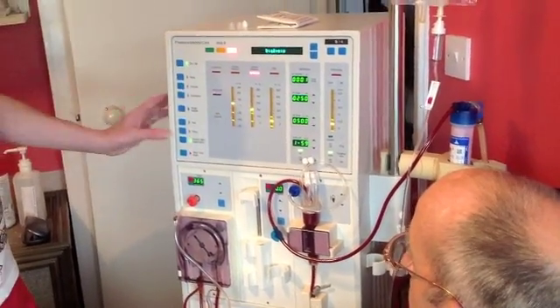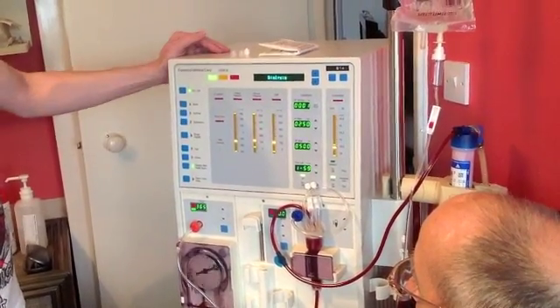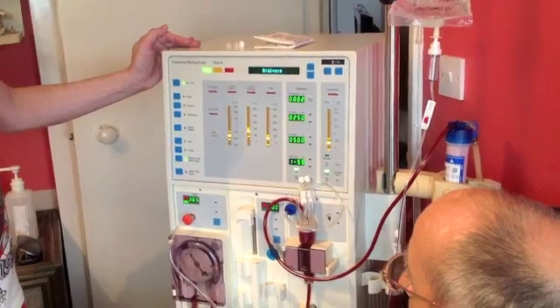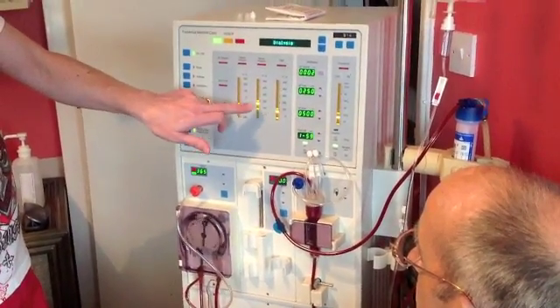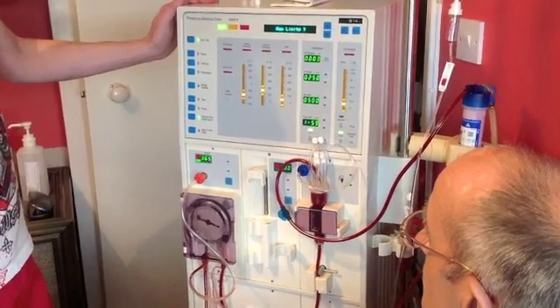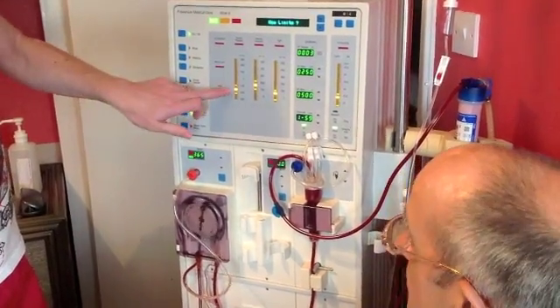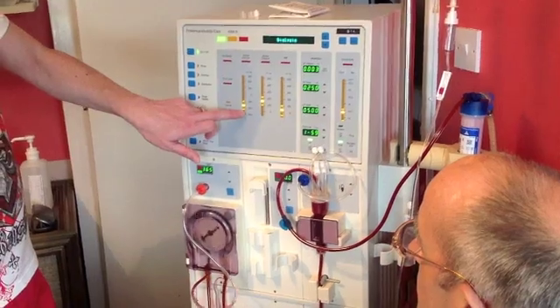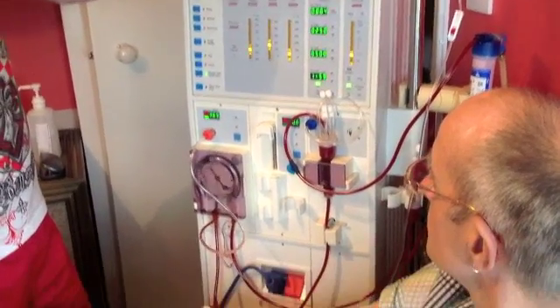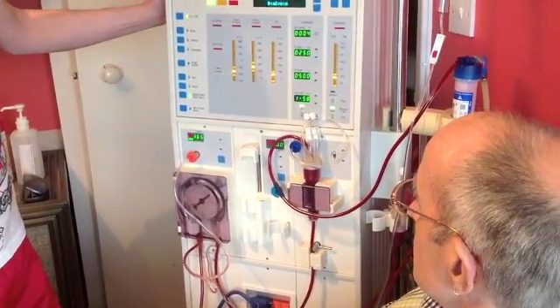There you go — venous pressure is doing that, nothing to worry about. Just press one, two, three. And again it will reset its levels, and over a period of time you will get to know your individual patient's normal figures. Alan usually sits around 140 to 160 on it — it's a little bit tight on there just to give it a bit of leeway because it will fluctuate while he's on the machine. If it's down low, we will normally look at the needling and maybe have to change the needle position because it's not a good flow. But I can tell, and Alan can tell, these are good flow figures and we have no worries.